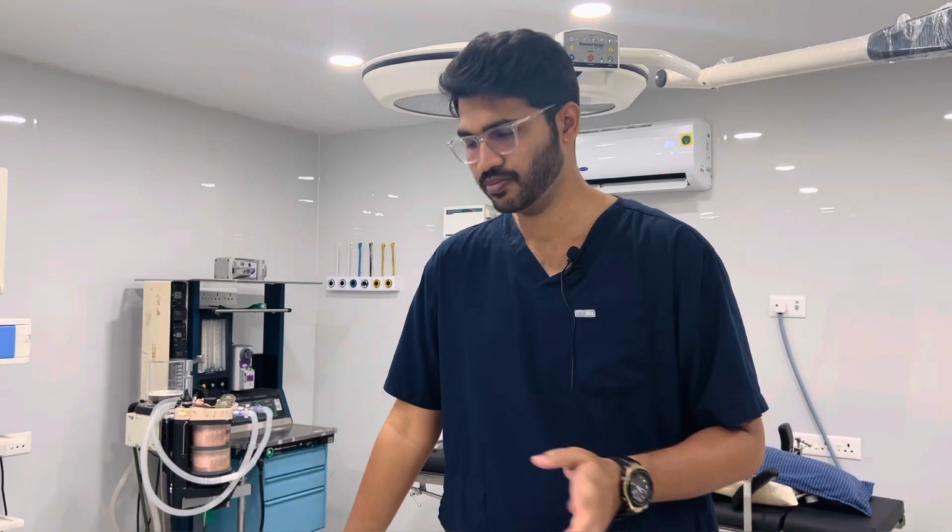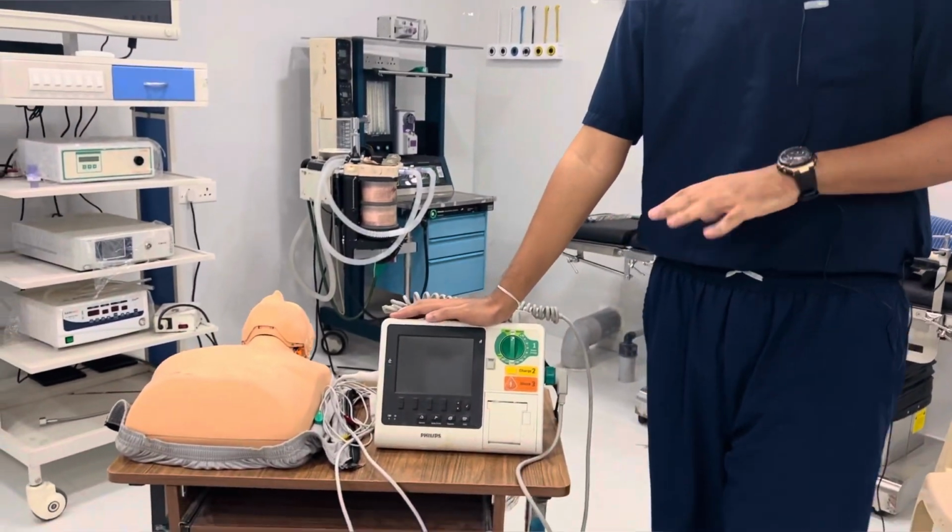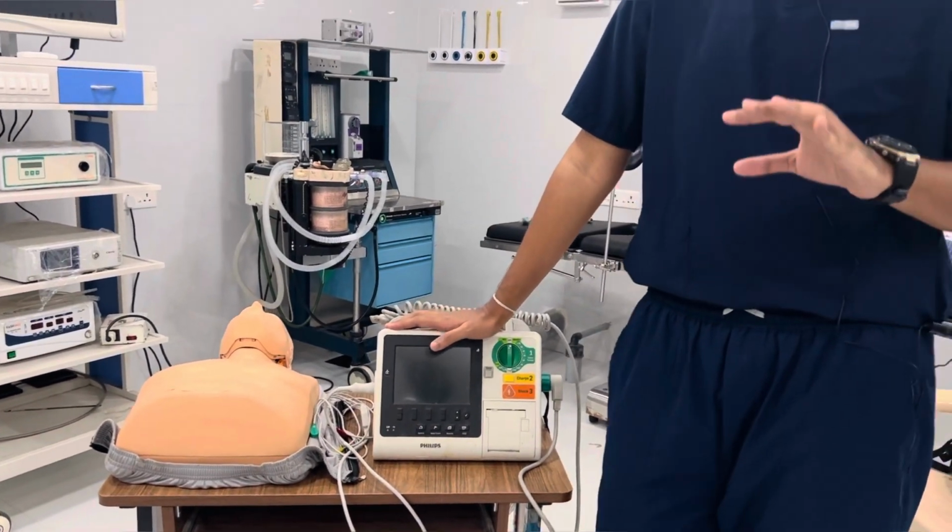Today we'll talk about the defibrillator in detail, and this will be useful for both undergraduates and postgraduates. To talk about defibrillation, first, it was invented in the 1950s, and there are three types of defibrillator. One is biphasic, one is monophasic, and another is called AED, the automatic external defibrillator. That AED I will cover in a separate video.